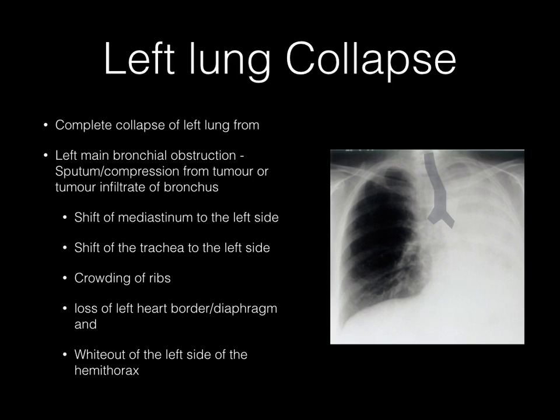But the important thing is that on examination, you may notice that the hemithorax is not moving at all on inhalation, and you need to examine the patient and compare between pneumothorax versus collapse of the left lung. On X-rays, on occasions you may not be able to completely differentiate a complete left lung collapse quite easily.